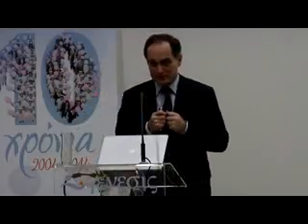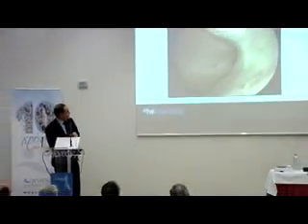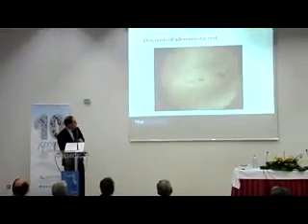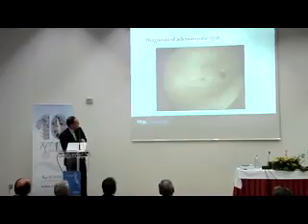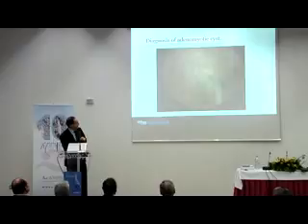But if we want to do some surgery, so we have now tissue sampling, but now we need to remove something because there is something. It is debatable to do this without anesthesia, with a little bit of sedation, but some do it without anesthesia. Here we see a little myoma polyp, and here the tubal ostium, a little hole here. We drop the pressure and we see some vessels.